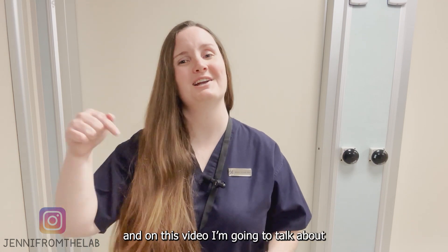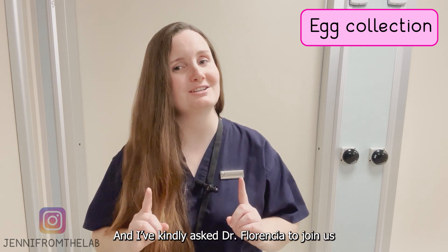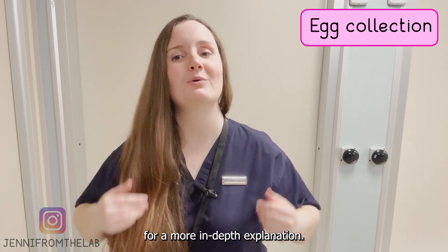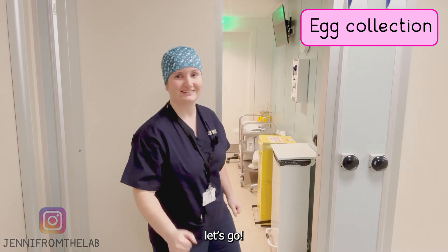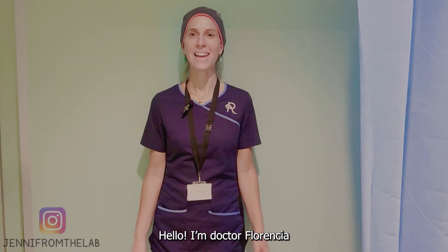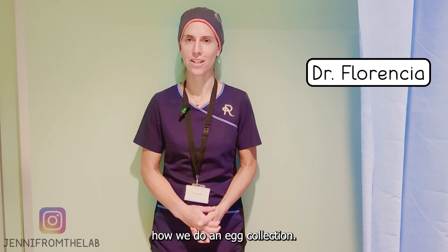Hi, this is Jenny from the lab, and in this video I'm going to talk about how we perform an egg collection. I kindly asked Dr. Florencia to join us for a more in-depth explanation. Hello, I'm Dr. Florencia, and today I'm going to show you step by step how we do an egg collection. I hope you enjoy it.